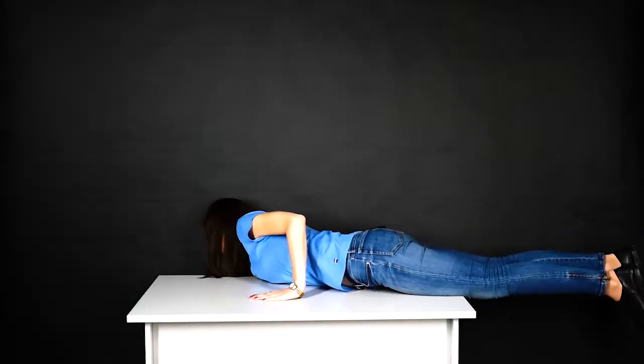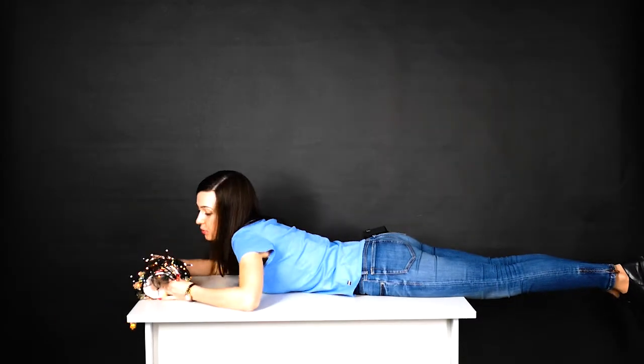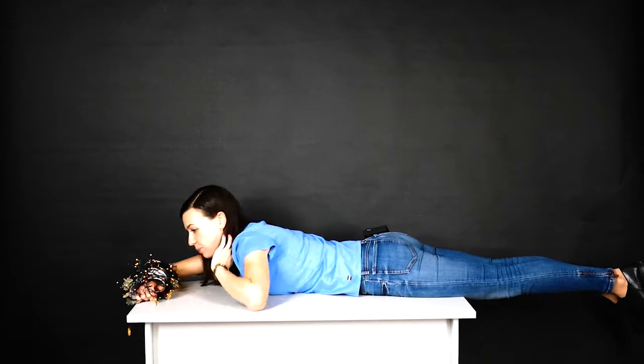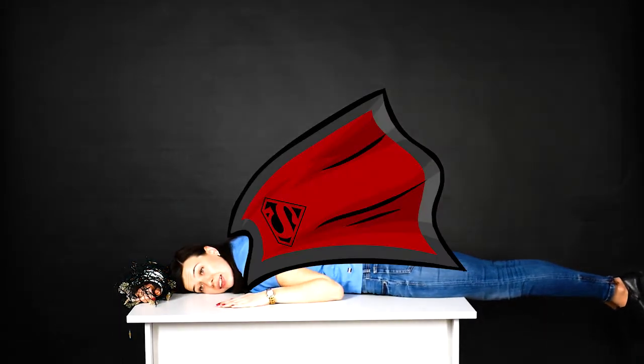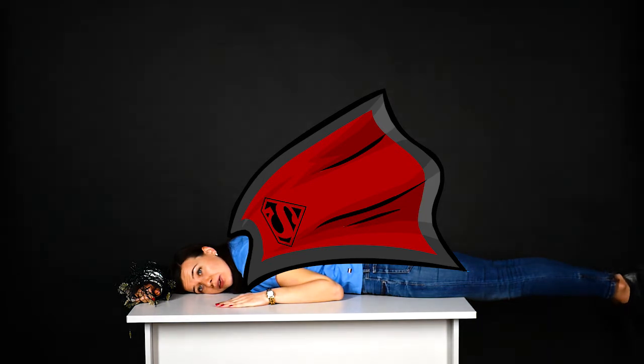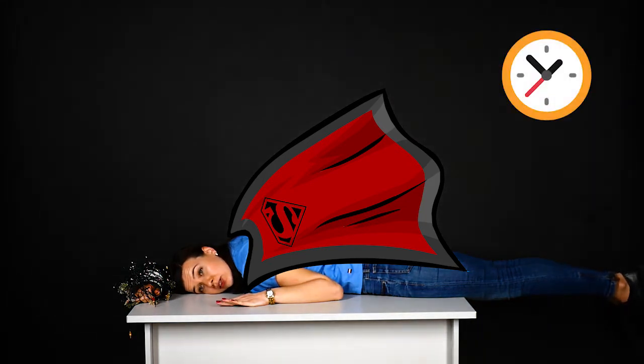place your arm in a special box with the cables and take a pose of a superman. And in this pose you need to lie motionless about 30 to 40 minutes while the doctor takes high quality images of your wrist.